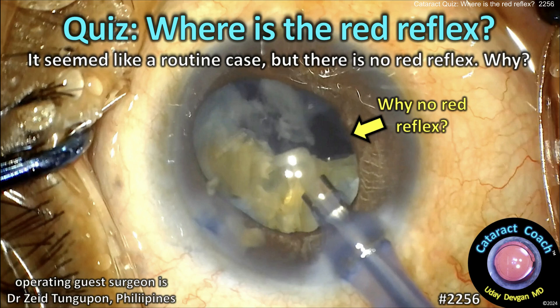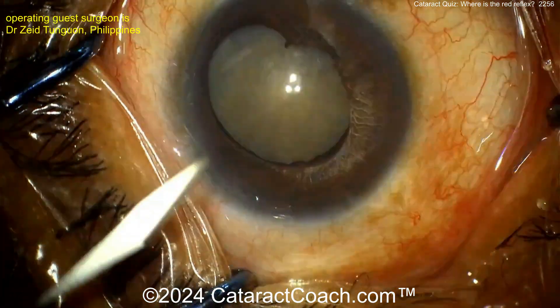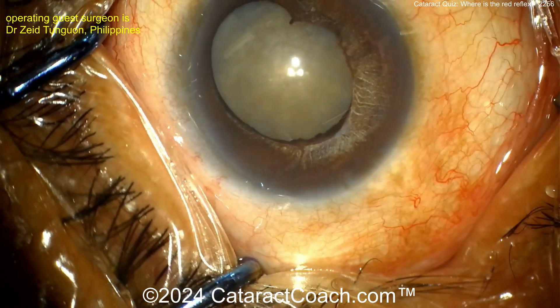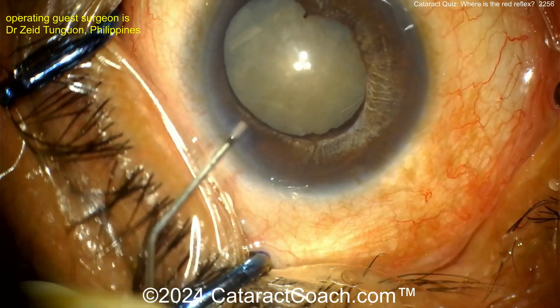Welcome to cataractcoach.com cataract quiz: where's the red reflex? This seemed like a routine case, but there's no red reflex — why is that? Let's watch. This has obviously been sped up. It looks like a tough case, maybe some prior trauma or prior inflammation.